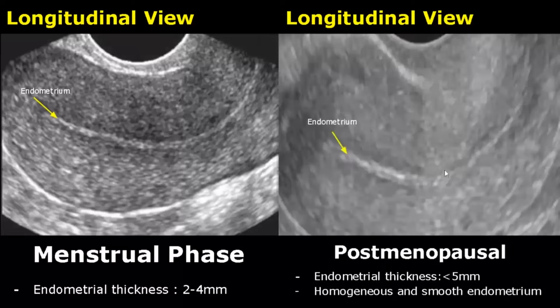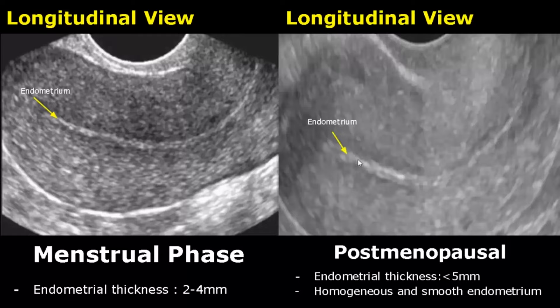In a postmenopausal woman, there are no more menstrual cycles, so the endometrial thickness is usually less than 5 mm and it will appear smooth and homogeneous.